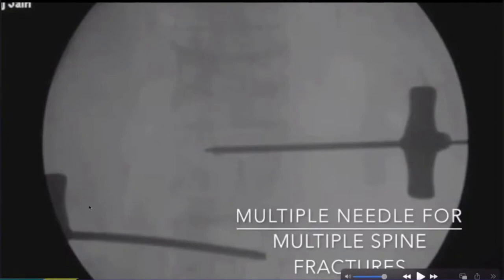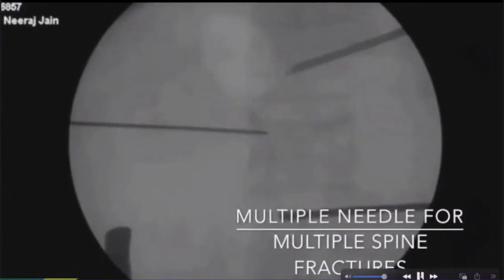It won't allow the procedure to be done. They're very close to each other, unless it is really required to go from the same side. So this is important: multi-level fractures.